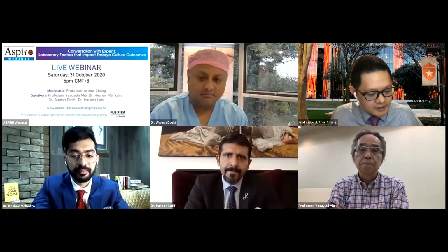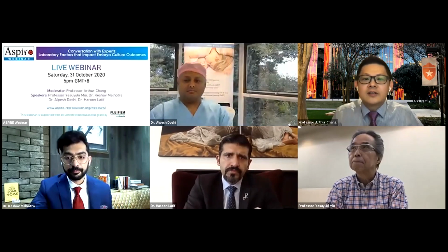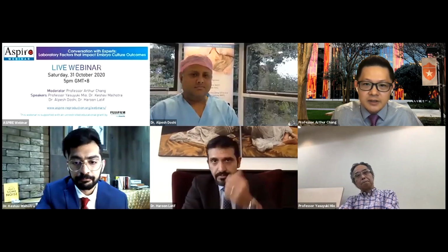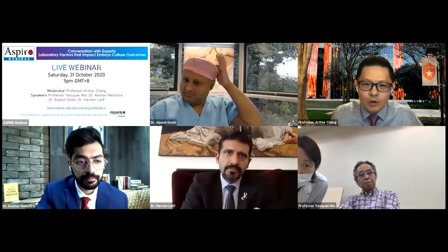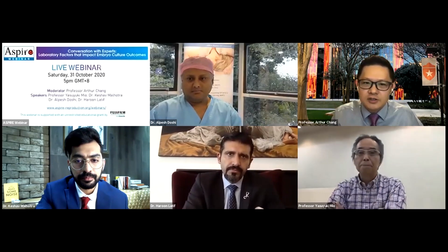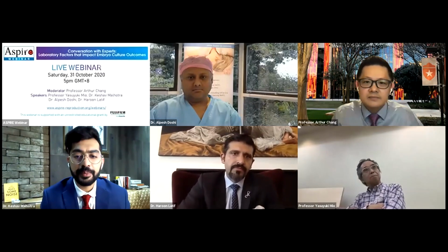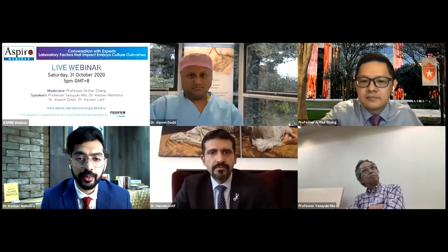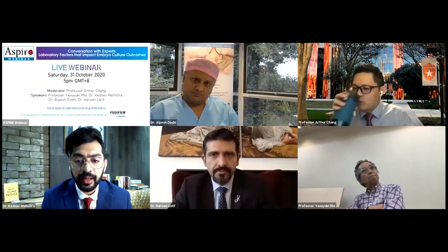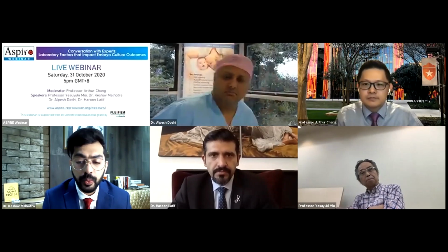And also the question about the re-expansion for the blastocyst. This one is for Dr. Malhotra. Do you think the re-expansion after the FETs, like thawing or warming, is critical, or would you suggest just an immediate transfer after the thaw? Okay, so my personal preference is that I wait for about an hour post warming, and most of the times we get re-expansion within this 1 hour.